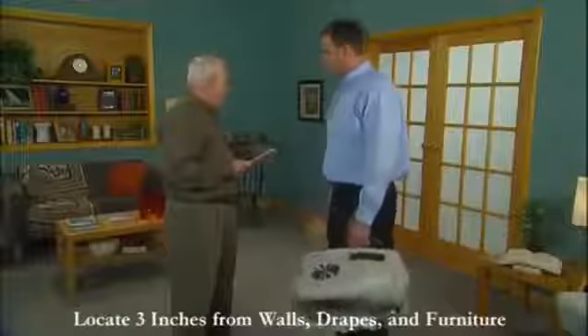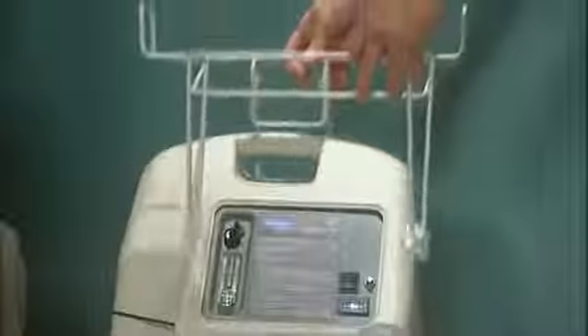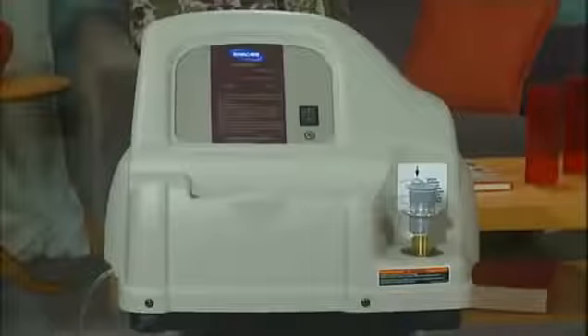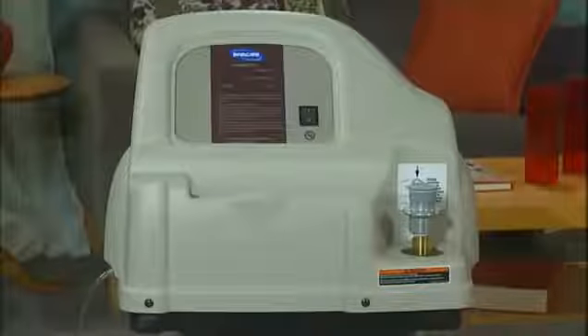Upon delivery, your provider will set up the Invacare Home Fill System for you. First, choose a location that is at least three inches away from walls, draperies, or furniture to ensure proper airflow. Install the proper ready rack for your concentrator. Place the unit on the ready rack, specially designed to hold the home fill unit. If you choose not to use the ready rack, place the unit on a hard, flat, stable surface, like a table that is within five feet of the concentrator.